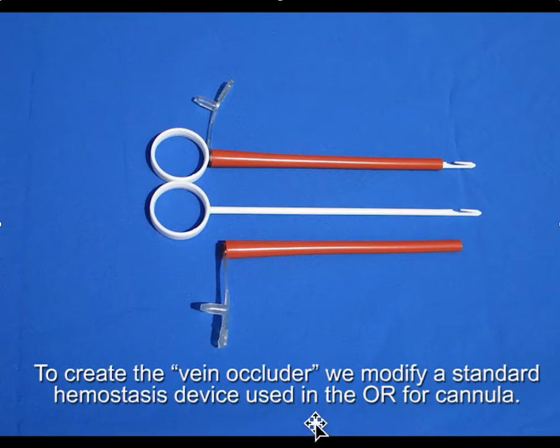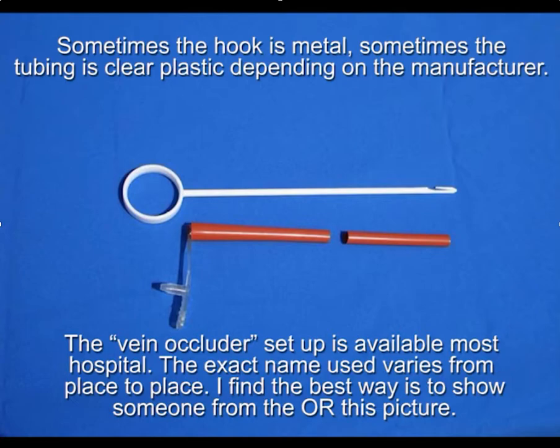To create this vein occluder, we modify an existing standard hemostasis device used in the OR for cannulation. In the package, you get two plastic fish hooks and a piece of soft rubber tubing. What we do is simply cut off the rubber tubing like this. Sometimes this hook is metal, depending on what your OR uses, and sometimes the plastic tubing is clear — it depends on who you buy from.